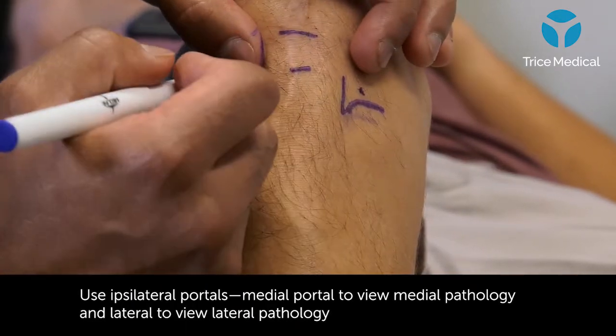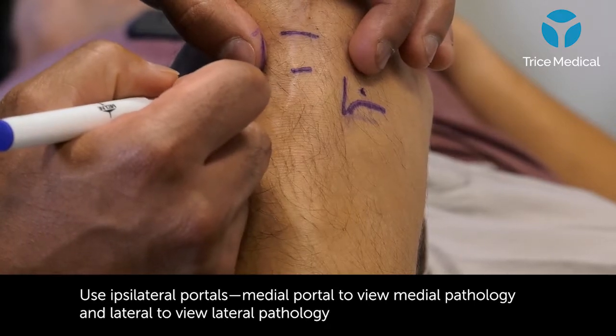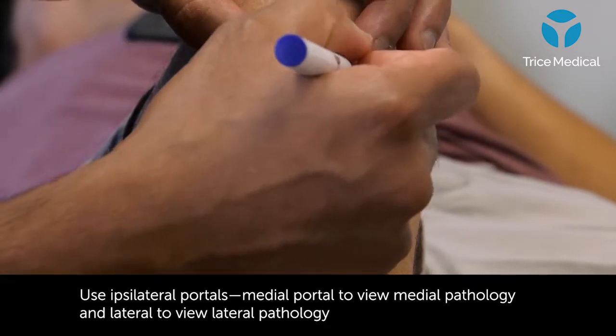If you look, it's slightly more lateral on the lateral side compared to the tendon relationship, compared to the medial side.